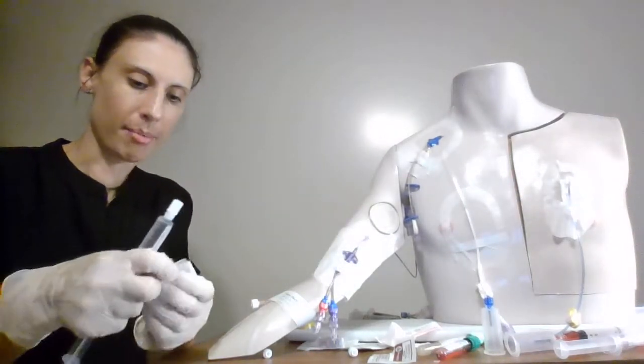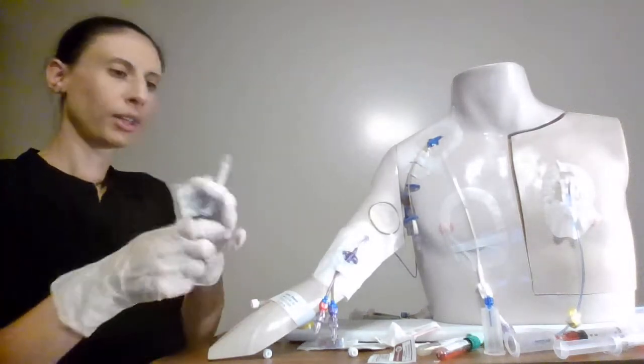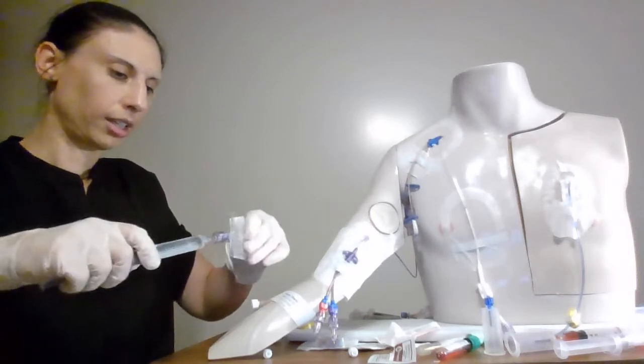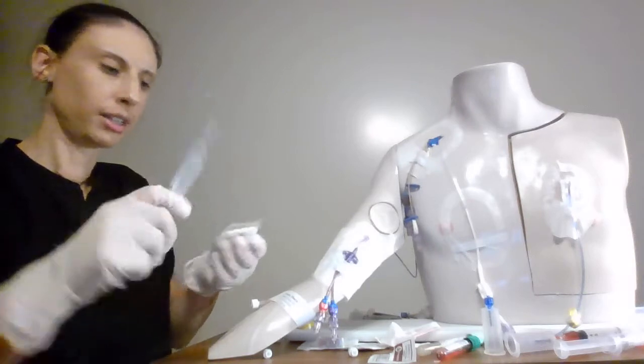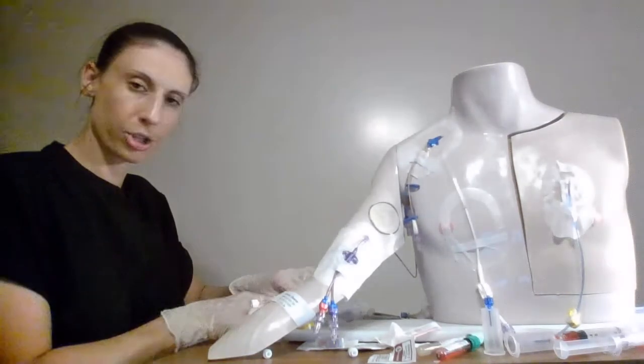We're going to banana peel that cap back. Don't touch the end. We want that to maintain sterility. And we're going to attach that onto there. And we're going to prime and get the bubbles out. And then we can tuck that back in. Make sure it's sterile. Take it to our patient's bedside.